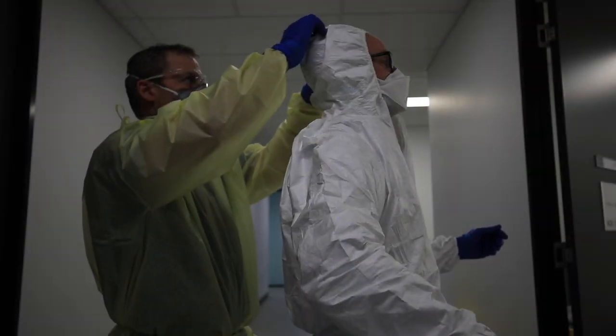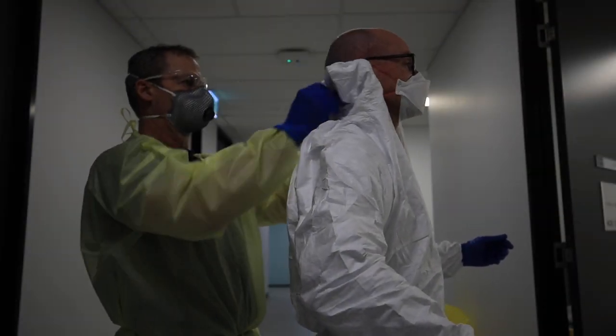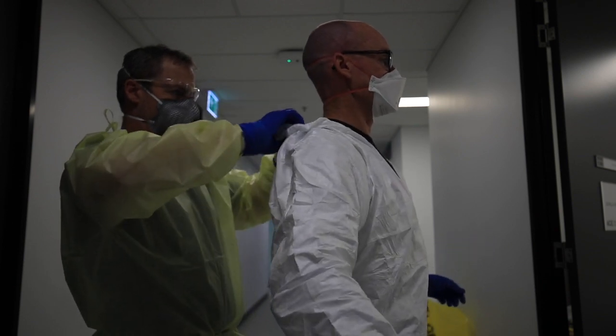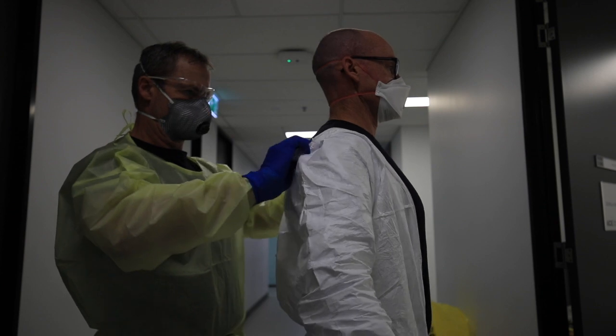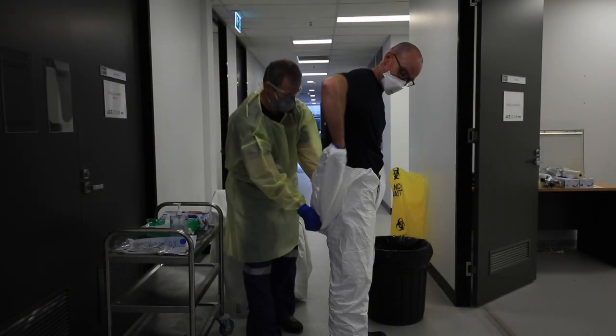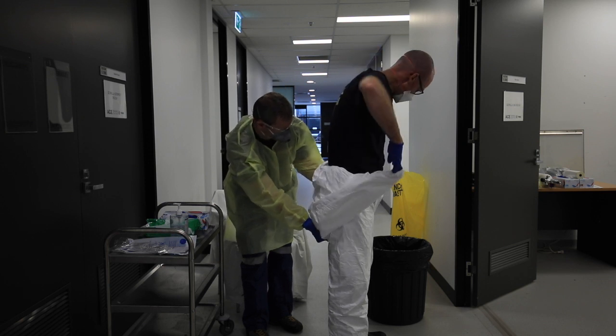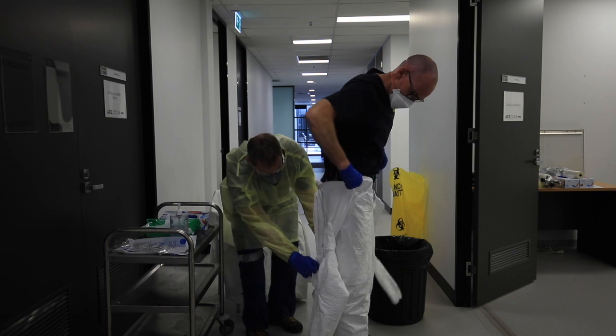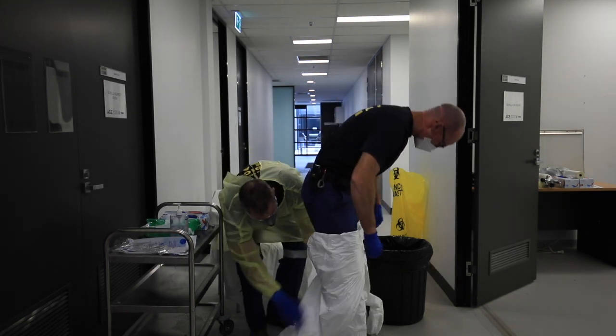Now rolling the hood back on itself so the contaminated surface folds inward — contaminated surface facing in. Then folding my shoulders out, rolling the suit down from the elbows, pulling my arms out slowly, leaving my inner gloves on. The assistant is rolling the garment down.